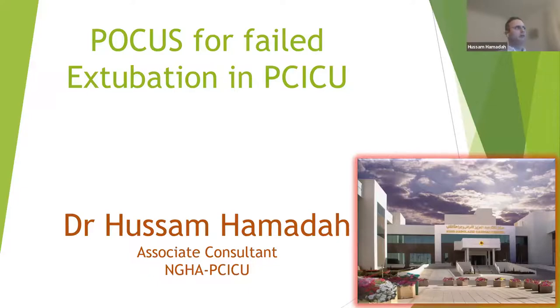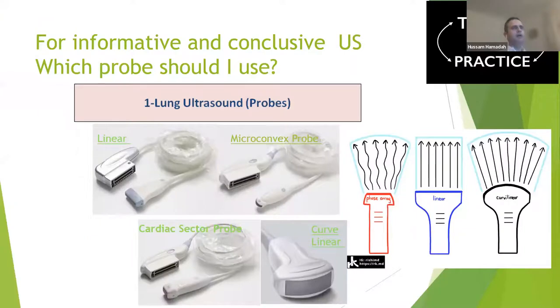Okay, I am going to speak briefly about point of care ultrasound for failed extubation in pediatric cardiac ICU. We have to mix between the theory and the practice. So we'll go from theory to practice and then we will go back from practice to theory.